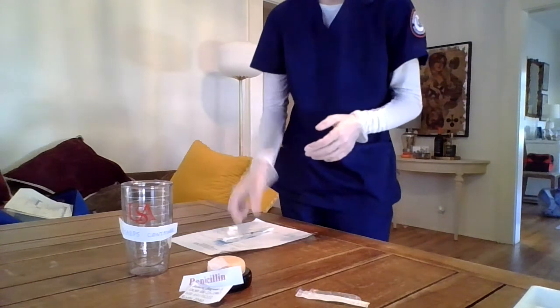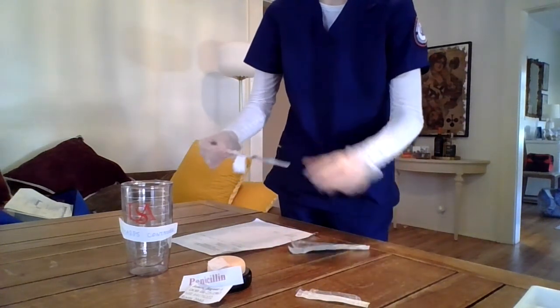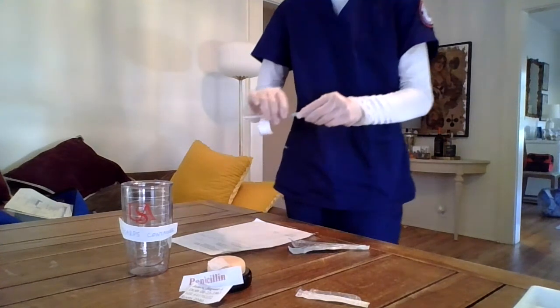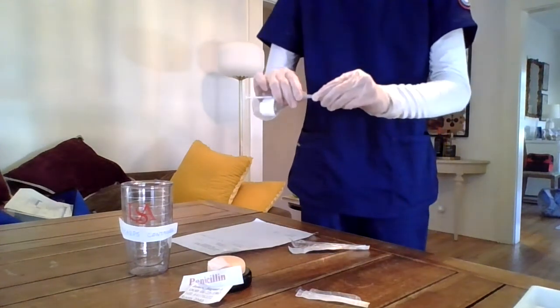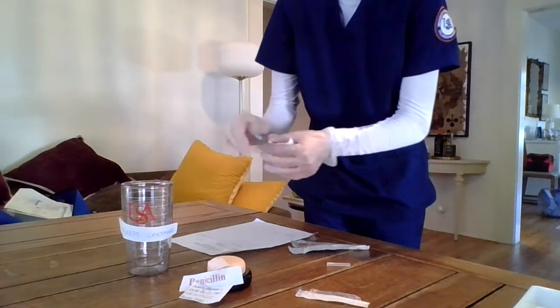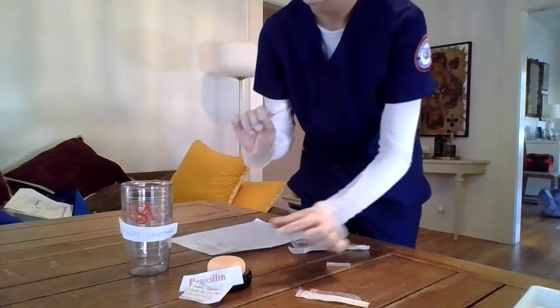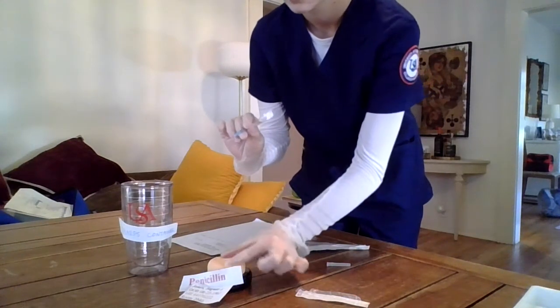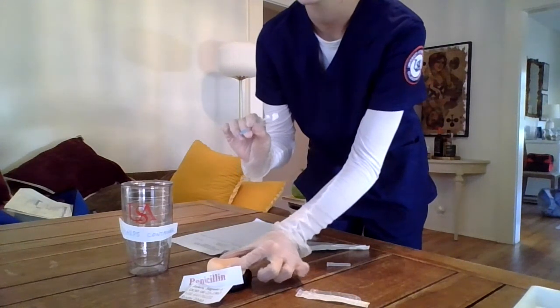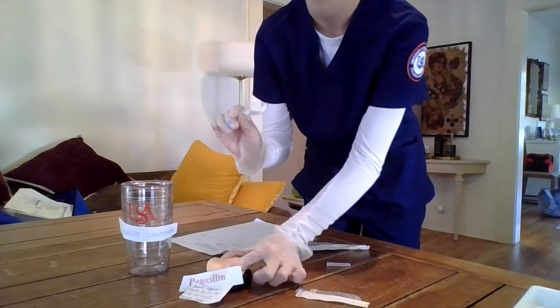Today I'm going to be giving this injection at a 45 to 90 degree angle, so I'll remove that. So I want to remove my cap. And now that I've allowed time for my patient's skin to dry, I'm going to spread the skin, being mindful of where I just cleaned, noting that loose skin is harder to penetrate.